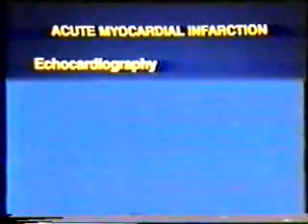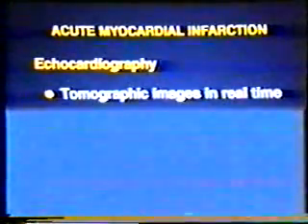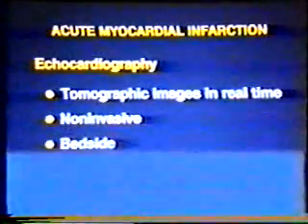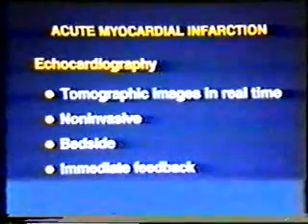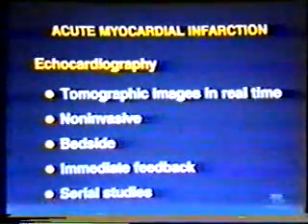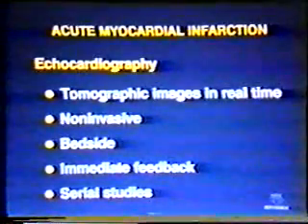Echocardiography is an ideal tool in this setting. It provides tomographic images of the ventricles in real time and this important information is obtained non-invasively. The studies can be easily performed at the bedside, and the cardiologist is provided with immediate feedback about the structure and function of the heart. Furthermore, echocardiographic studies can be repeated in serial fashion as often as the clinical situation dictates.